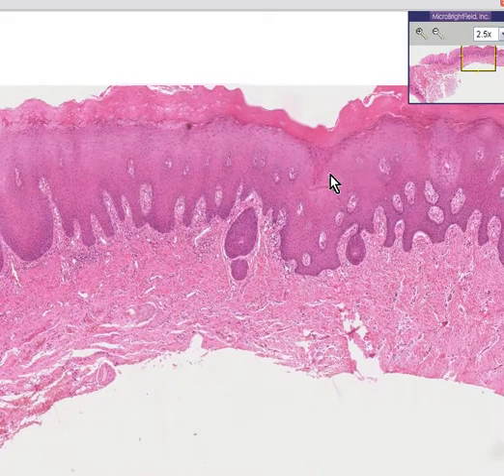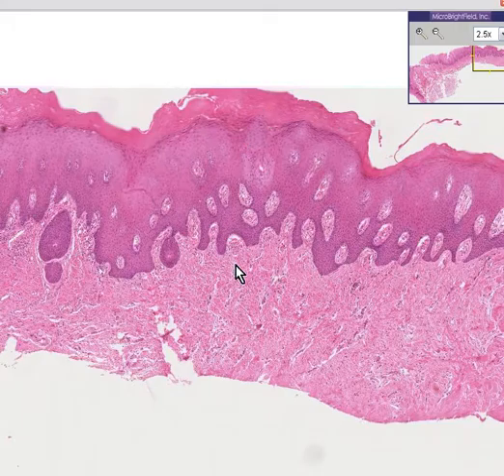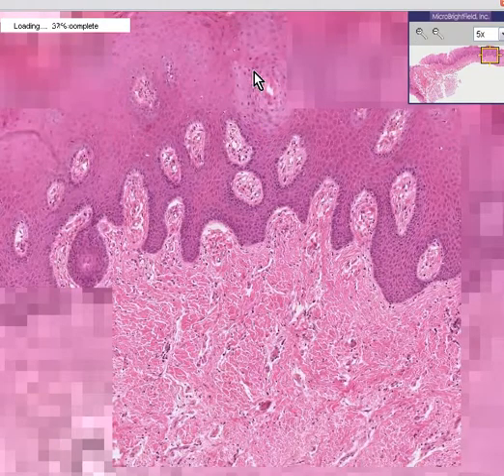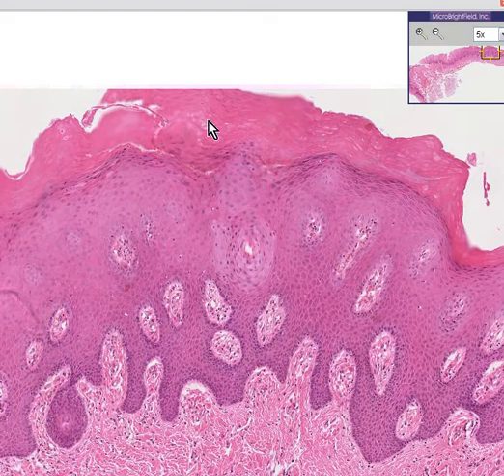In this case, it does keratinize. You could see that not only is there a stratum corneum, which there shouldn't normally be in the mouth, but it is thick. And the general rule in nature is that whenever a stratified squamous non-keratinized mucosa is subject to an increased amount of mechanical trauma, abrasion, so forth, it will develop normally a thickened layer of keratin.